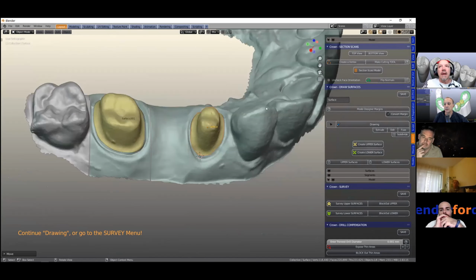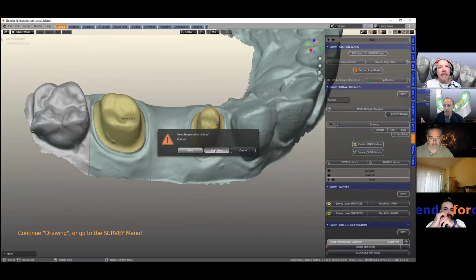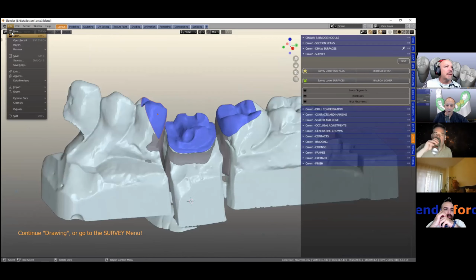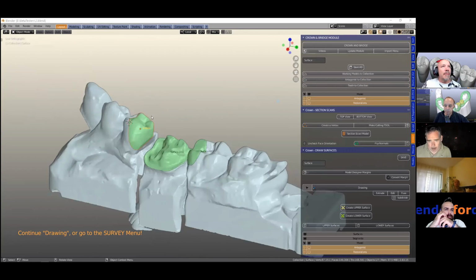Okay. So it helps with the direction of the margin, did you say? The way it extrudes outwards from the abutment. Yeah, that about sums it up. All right, so we're going to go there.